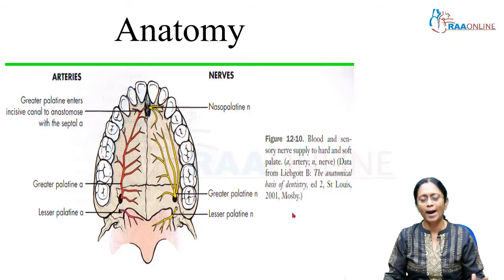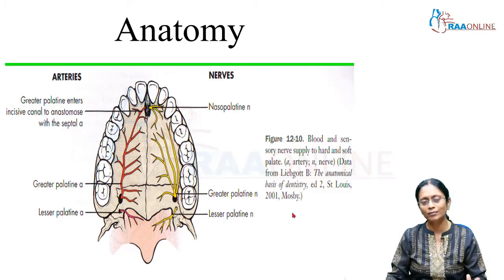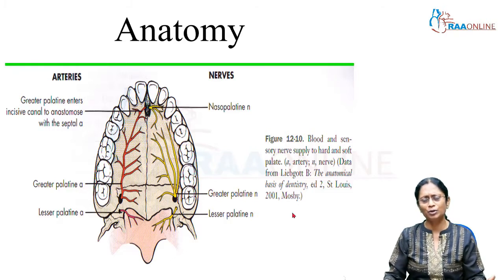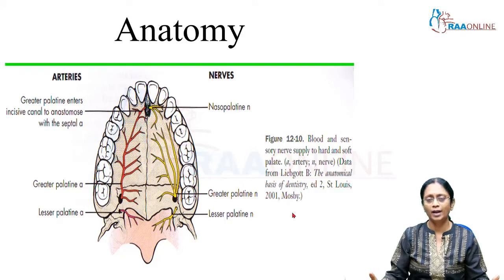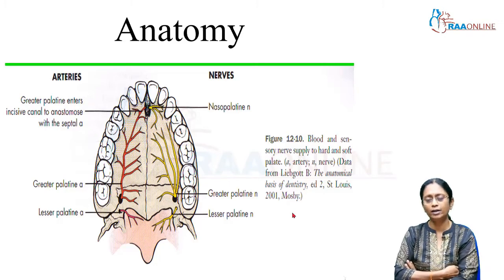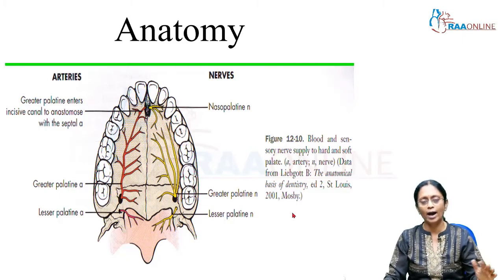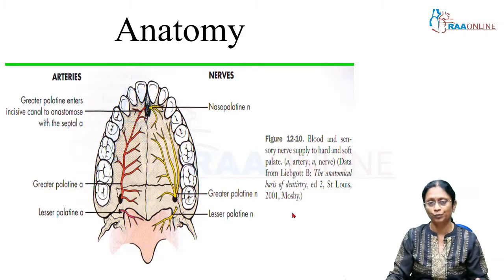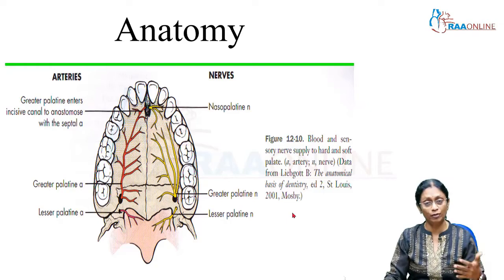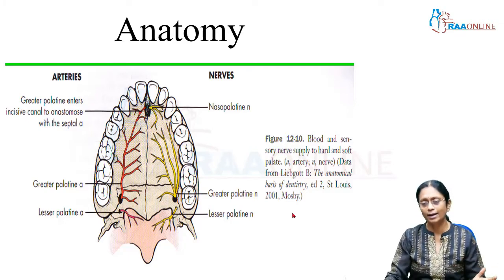Well, let's talk about the mandible later on, but today it is mainly to cover the maxillary local anesthetic procedures and the different types of anatomy and techniques involved with the maxilla. The maxilla is quite a soft bone and not very difficult to handle. The cortices are not that bad, and you also have nerves that are readily accessible, unlike in the mandible. In the mandible, the inferior alveolar nerve enters the mandibular foramen and runs entirely in the bone. Whereas in the maxilla, most of these nerves are superficially placed, either buccally, labially, or palatally, so they are very readily accessible.